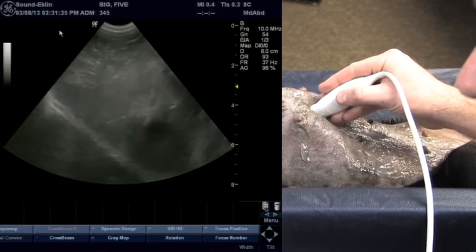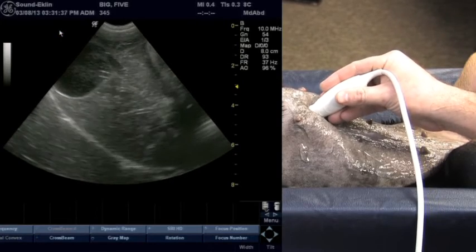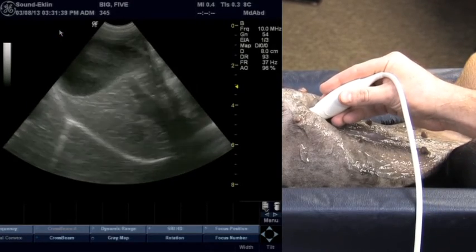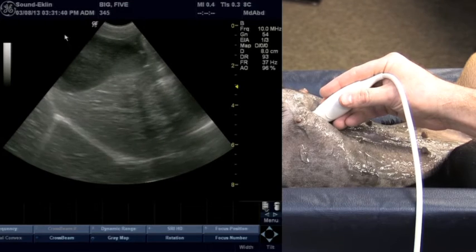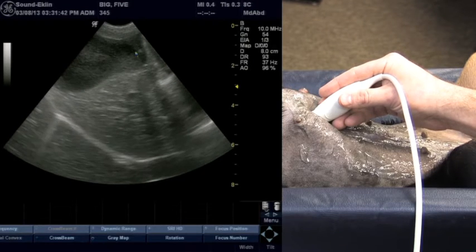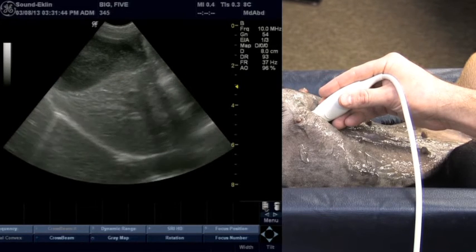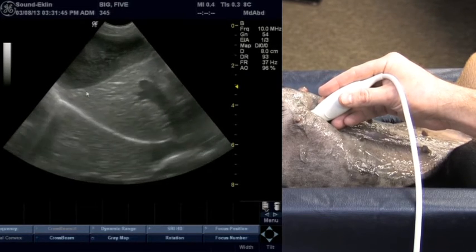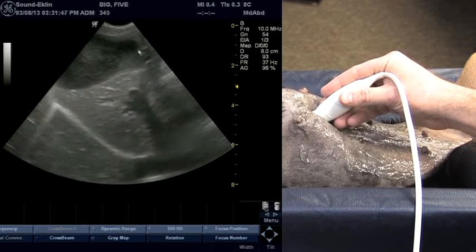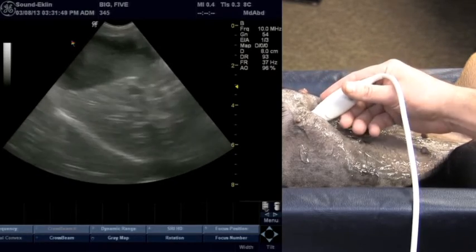Starting at midline and sweeping just towards the right — the dog's right — the gallbladder comes into the field of view. Here is our gallbladder; it has a nice thin wall, less than two millimeters. We can see where we have sludge in the lumen of that gallbladder.